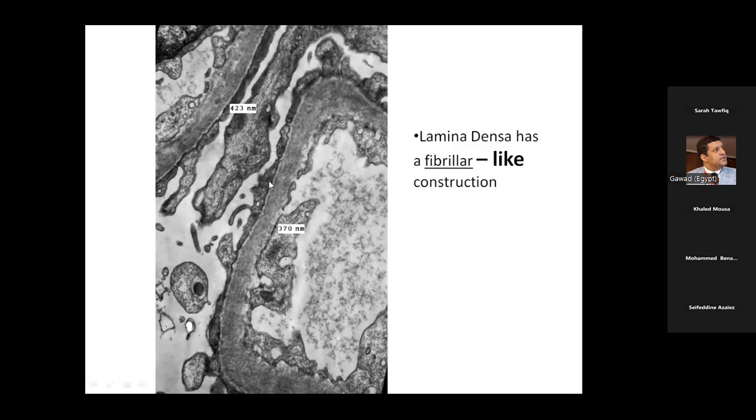This membrane is normal. It's fibrillar like, and there is a difference between fibrillar and lamellation. Later on, when we discuss Alport, you will see the actual meaning of lamellation. Sometimes it's difficult to say that it's lamellated, because a disease like Alport syndrome is a progressing disease, and we may have pictures that are not conclusive, and a follow-up biopsy may be required to have a conclusive diagnosis.